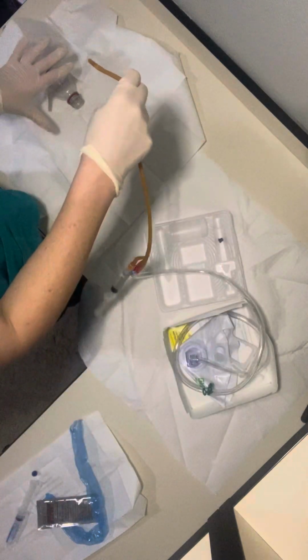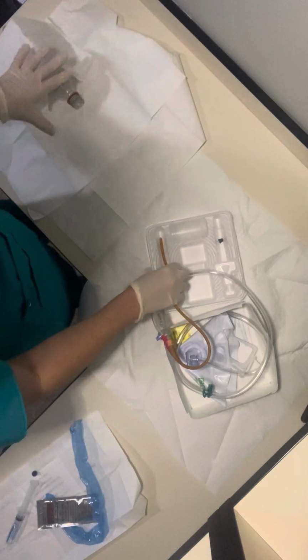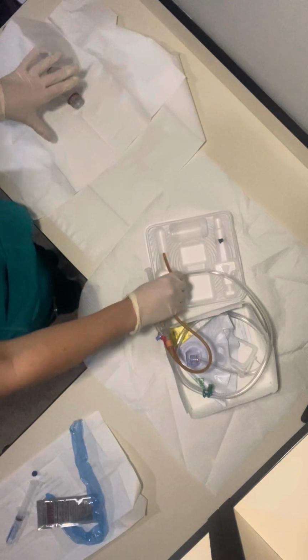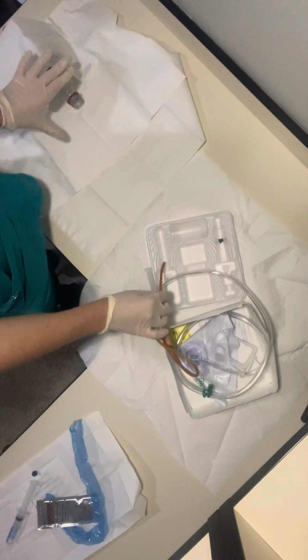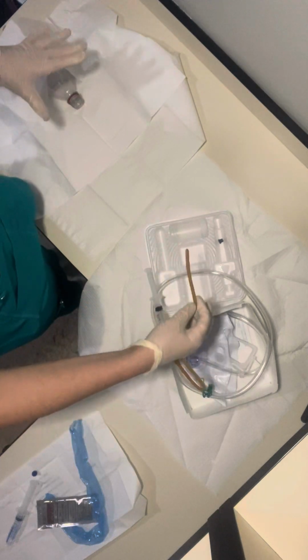And I wouldn't sneeze. I apologize. I don't know where that came from. But if I had to sneeze or thought I was going to sneeze, I would wear a mask just to ensure that I didn't contaminate my sterile field. So because I sneezed and didn't have a mask on, I would remove everything and start over.